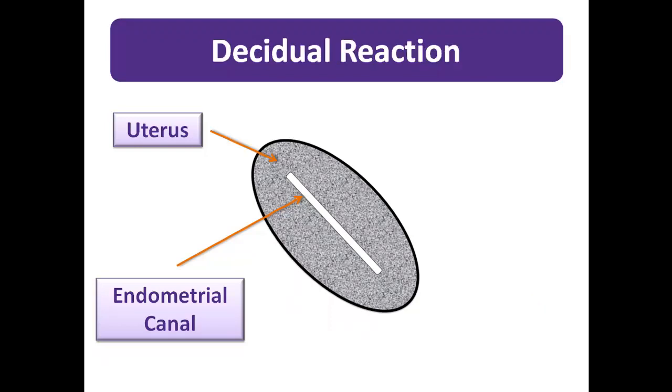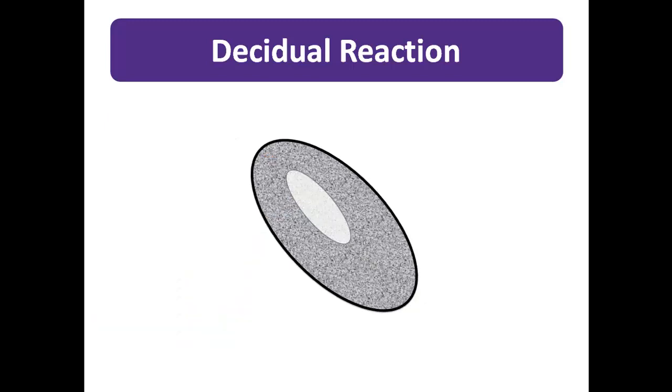As the cascade of early pregnancy unfolds, and as implantation of the embryo occurs, the endometrium undergoes a decidual reaction. Although this structural change can be defined by several descriptive, anatomic, and sonographic layers, in our simplified approach, we will visualize this as a generalized thickening of the endometrium occurring around the site of the presumed embryonic implantation. In and of itself, this thick echogenic lining does not define an IUP.